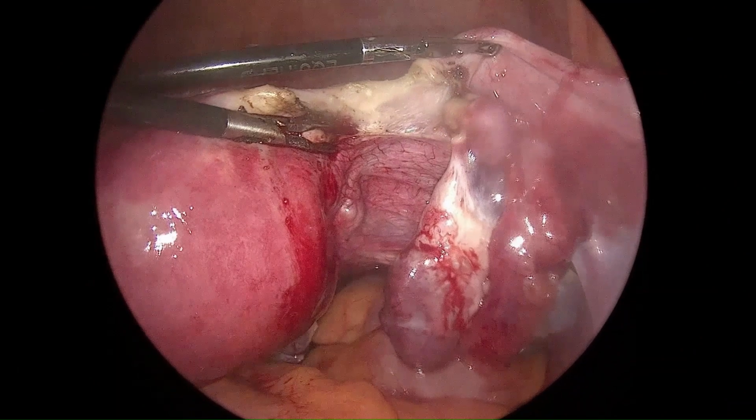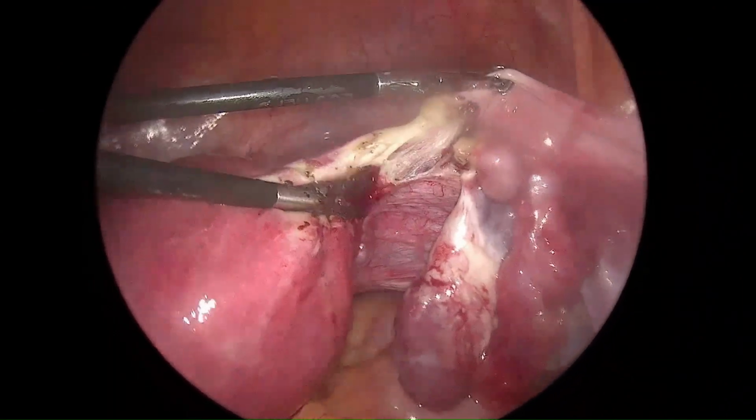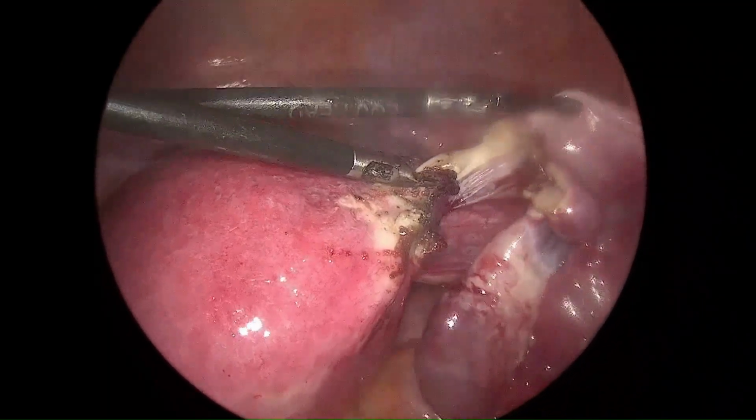This is how the bladder, which is adherent to the lower uterine segment or to the cervix, at about the previous caesarean section scar, is separated systematically. Hope this video is informative.